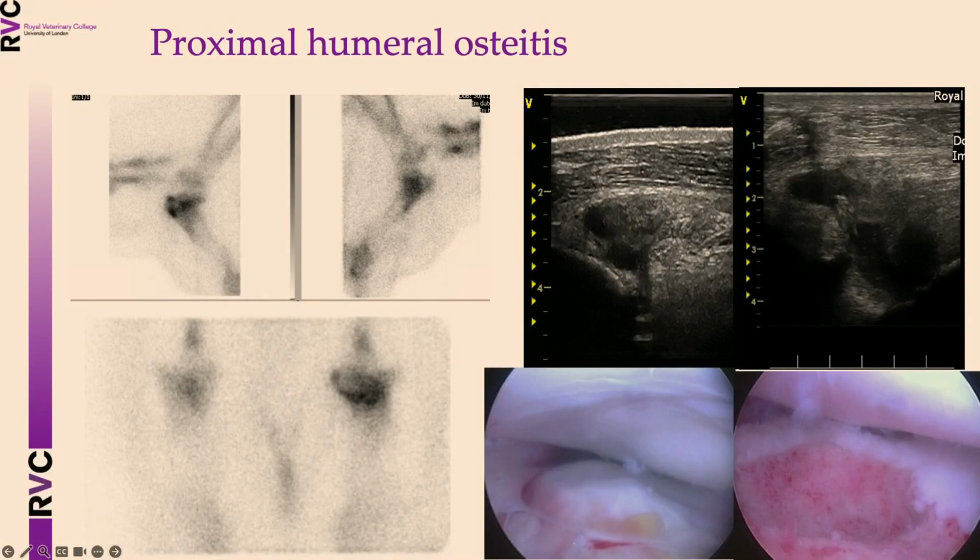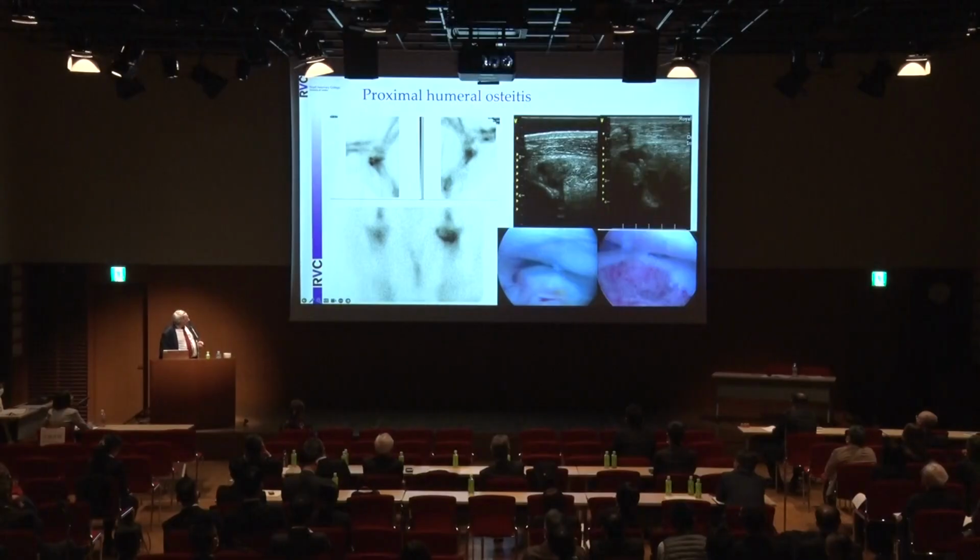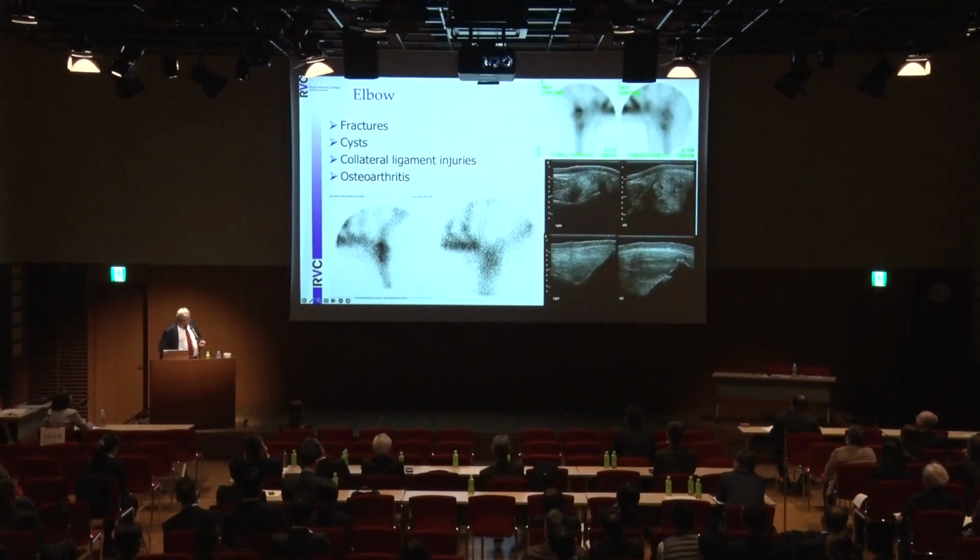As you can see here, it can be debrided, but also responds well to intrabursal steroids. It can be debrided, yes. And these can be very successfully managed as a result. The elbow, there are many abnormalities of the elbow, but it's a rare joint to be affected.